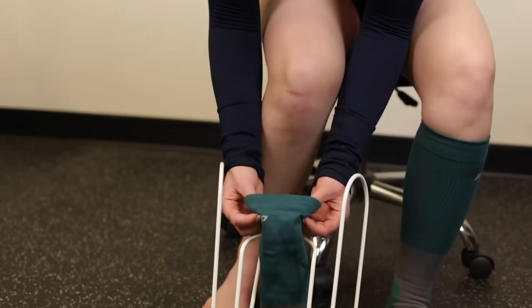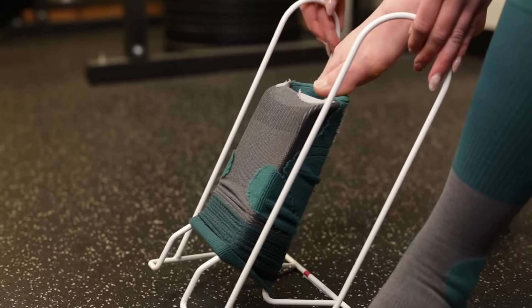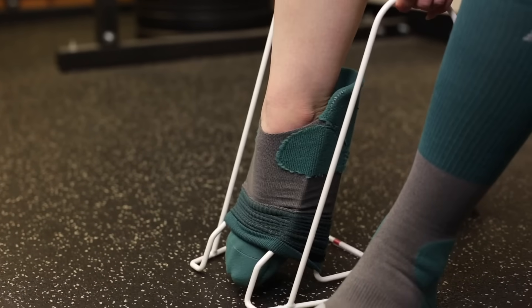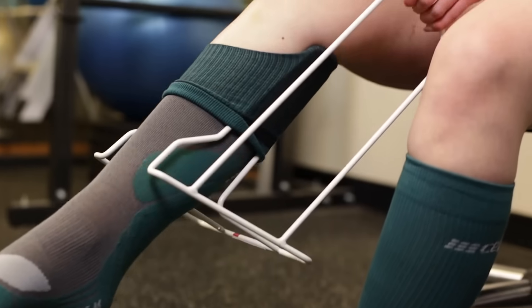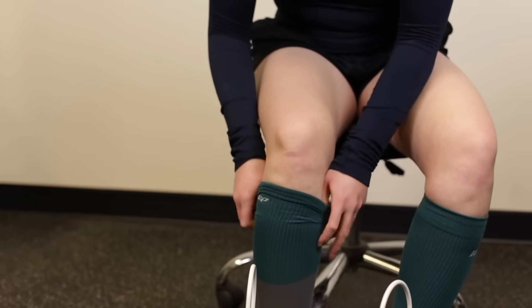Proper care will increase the lifespan of your compression socks, but elastic fibers will inevitably break down and wear. You should replace your compression socks every six months to ensure the right level of compression is still being applied.